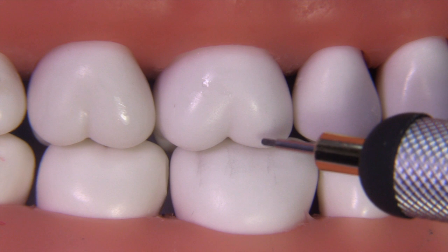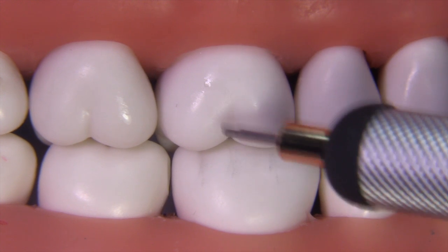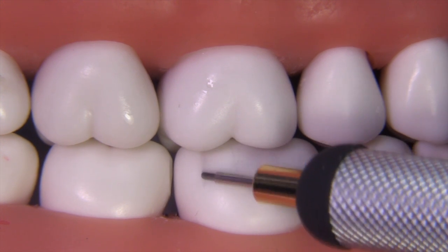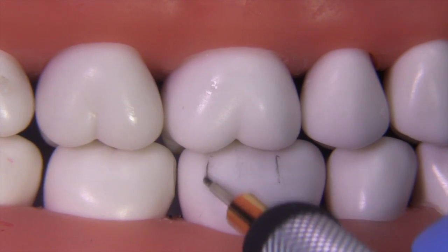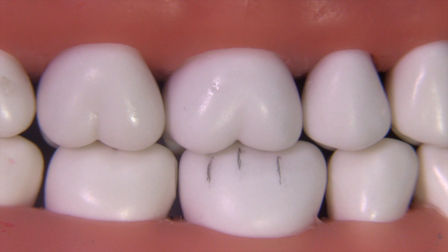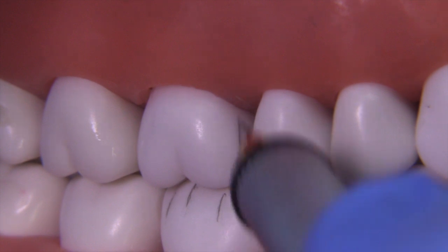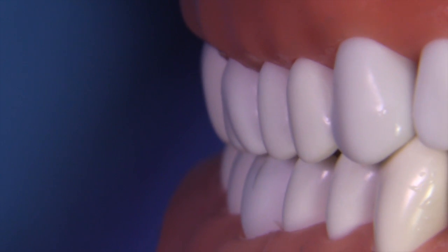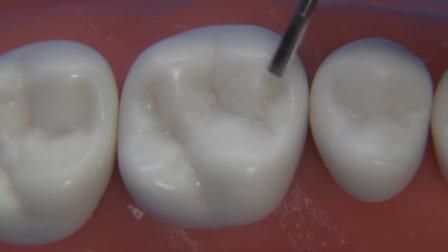We'll start by looking at the occlusion and getting an idea of where the cusps lay relative to the opposing tooth. We want to maintain a morphology of the reduction that mimics tooth structure — that tends to hide and blend the restoration better. Using a typodont, you can clearly mark where all your reduction planes need to line up. At about a 45-degree angle, put a pencil line to give yourself an idea of where that extension is going. From the facial, you won't even be able to see the gold.